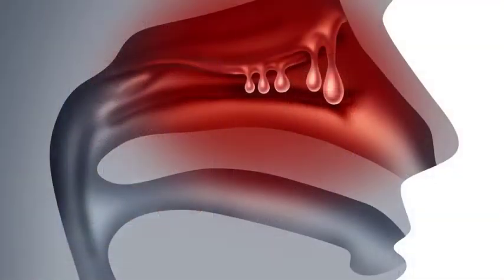More commonly, what we use navigational sinus surgery for is either revision sinus surgery, where the anatomy has been modified, or primary surgery where the anatomy has been obscured, like with nasal polyps, where you can't easily see the normal bony architecture. With navigational sinus surgery, we do much finer slices on our CAT scan of the sinuses, which allow us to see more intricately the sinus disease that's present. It also makes the surgery in some ways more safe because we can more clearly see exactly where we are in the nose using the navigational protocol.